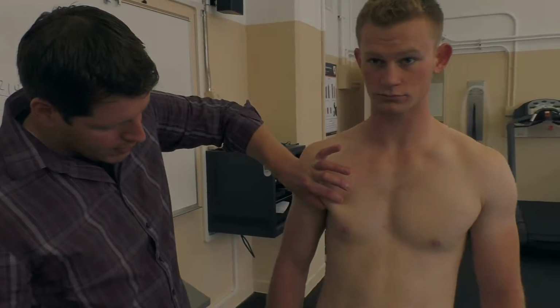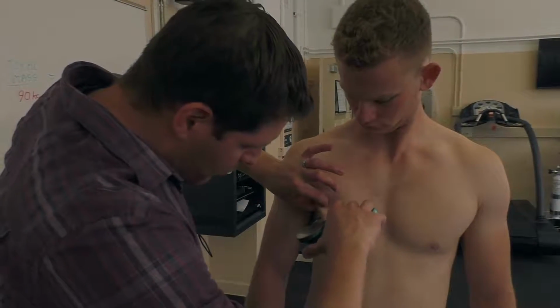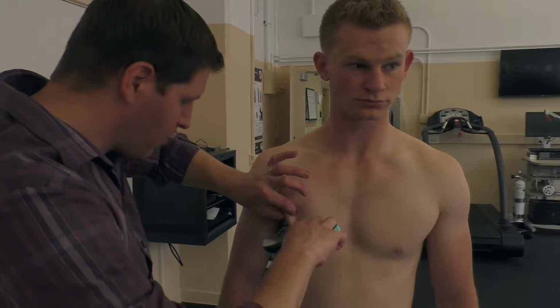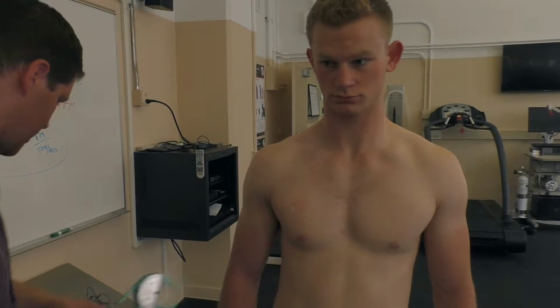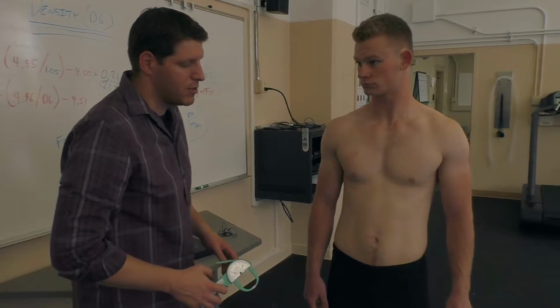I've got muscle. You can slowly retract the pinch, and you'll see the muscle slip out of my pinch there. Bring the calipers in, again making sure the caliper placement is about 1 centimeter away from the finger. Take the reading, which in this case was 6. You don't need to record these numbers. I'll give you the sums in just a minute.